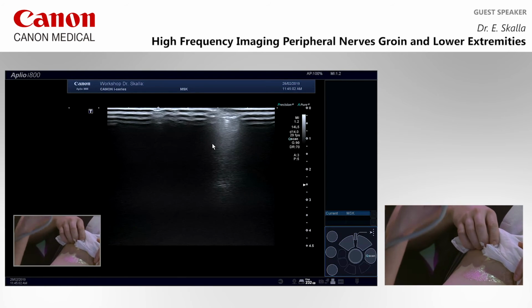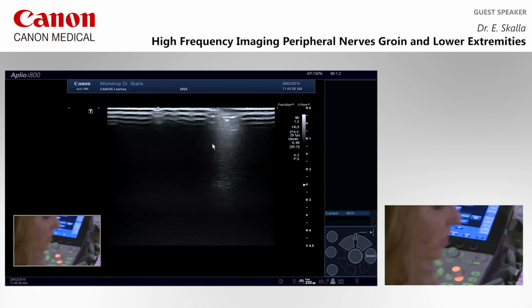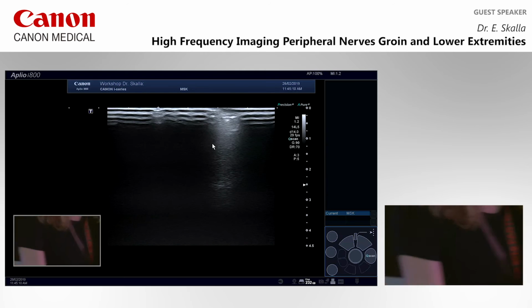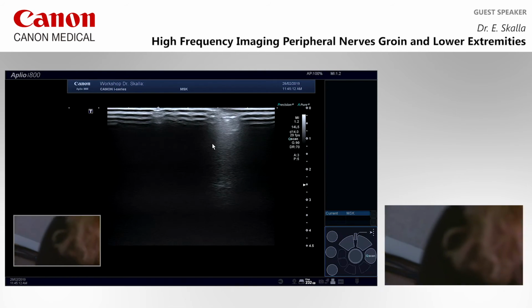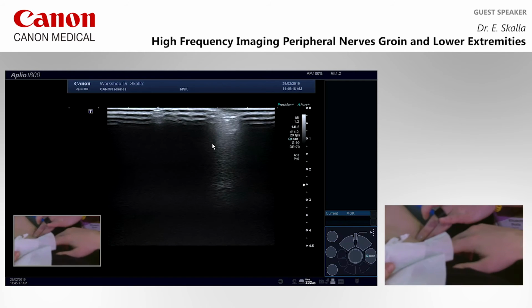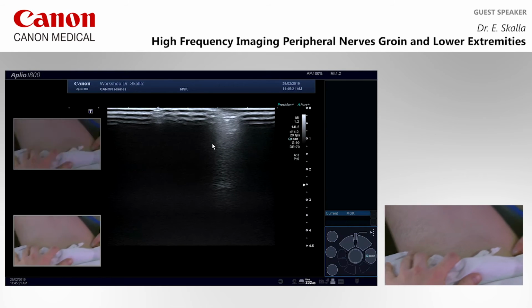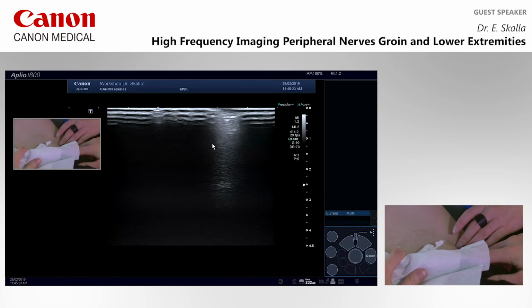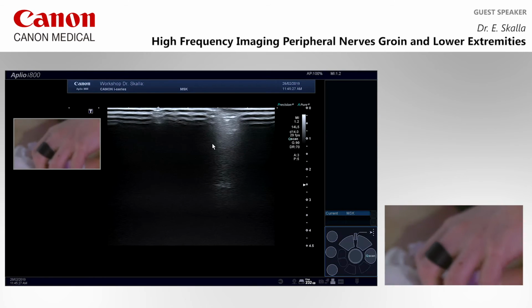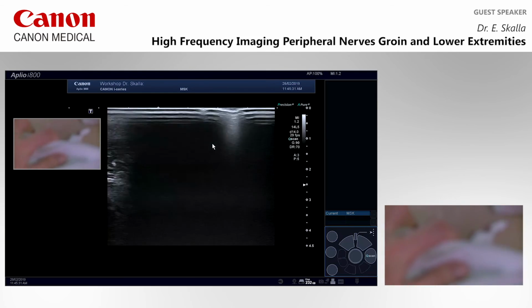The lateral cutaneous femoral nerve, we would just ask the patient to lift the limb a little bit, gerade ein bisschen anheben das Bein, and then we see and feel this groove here. Can you see it? No. It's getting tired now? No? Geht's noch ein bisschen? Here is this groove. I can feel it. Dann wieder hinlegen.